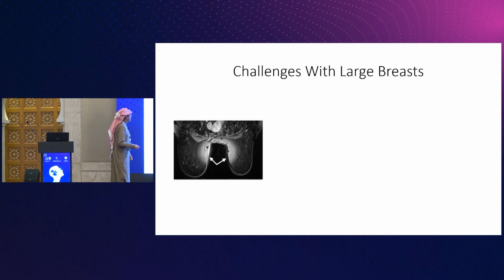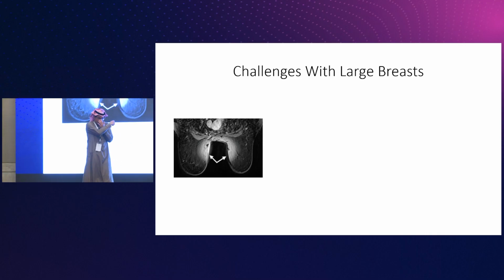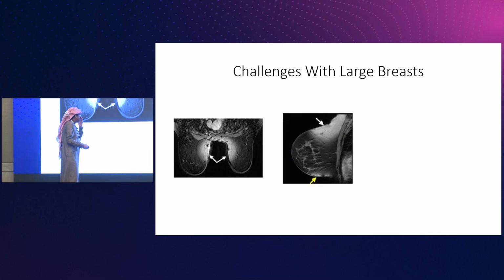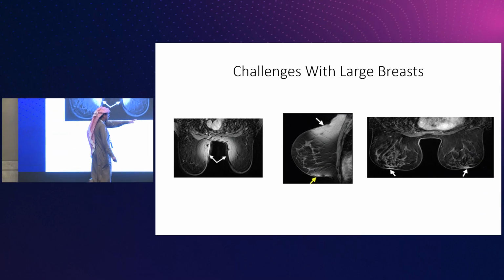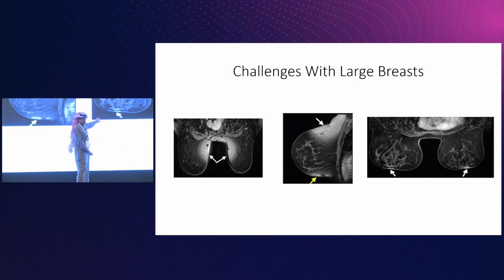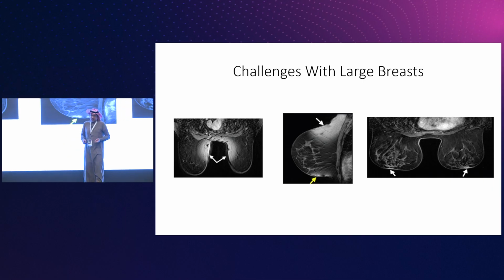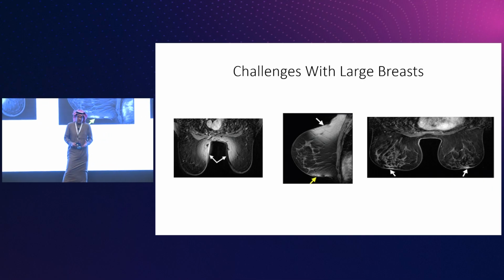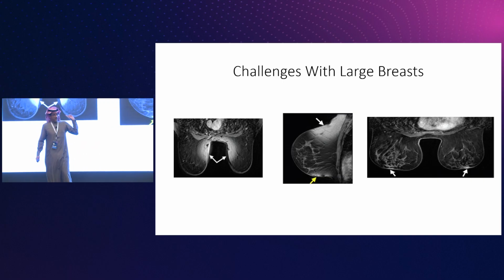Challenge with the big breast. There is a solution for this one. We said that we can put towels over the opening of the coil and elevate the patient a little bit, isn't it? Or the cup. But for this one, really, it's annoying.